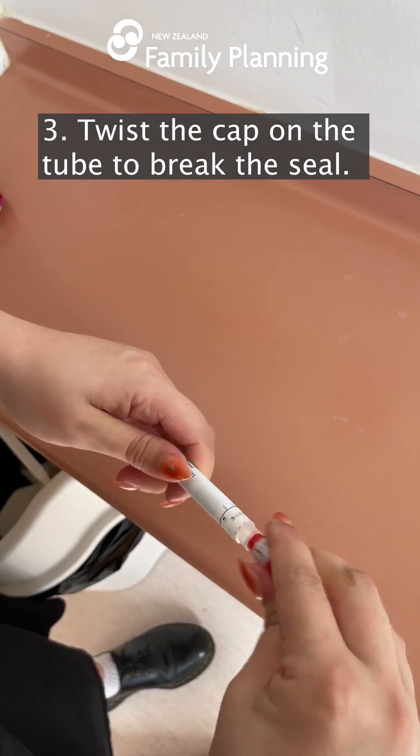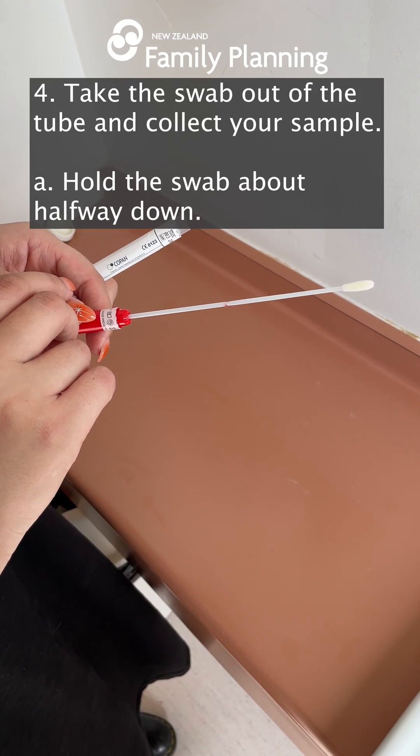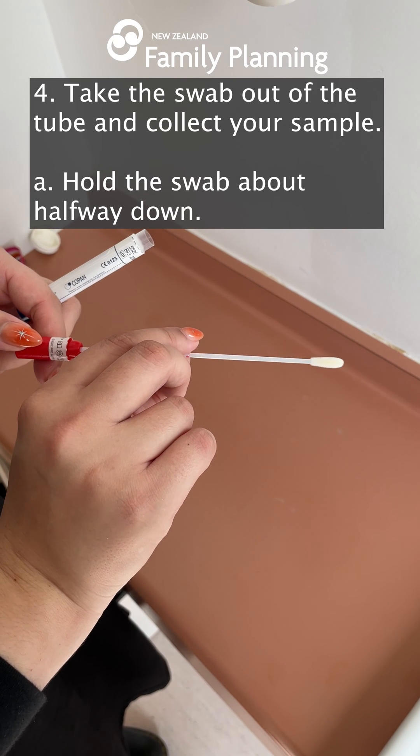Twist the cap on the tube to break the seal. Take the swab out of the tube and collect your sample.